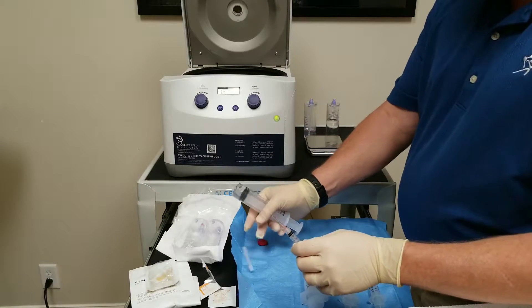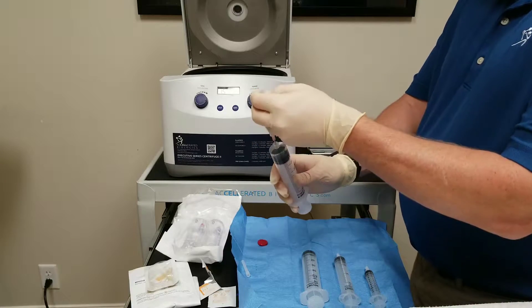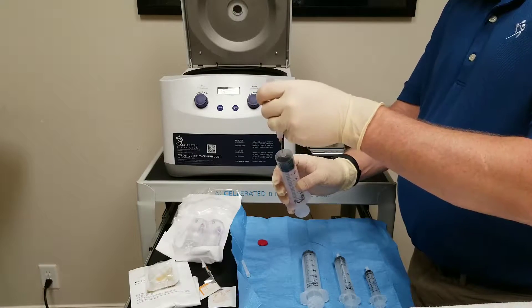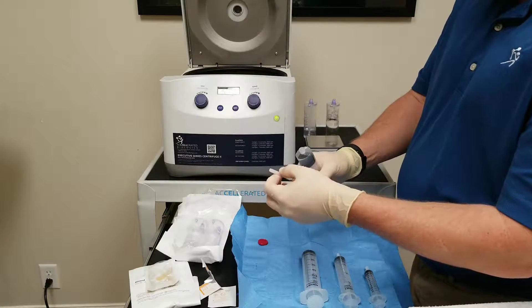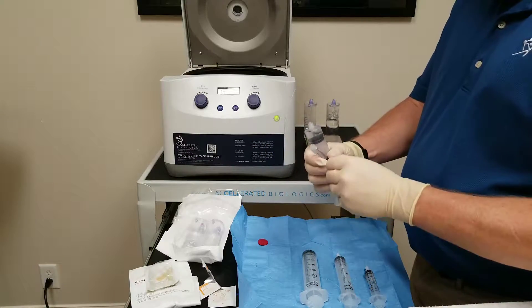Next step, I like to take about 2 ml from my anticoagulant, and I'll show you what this step is for in a moment. But this is part of our pure processing technique so that we have reduced leukocytes and neutrophils in our sample.